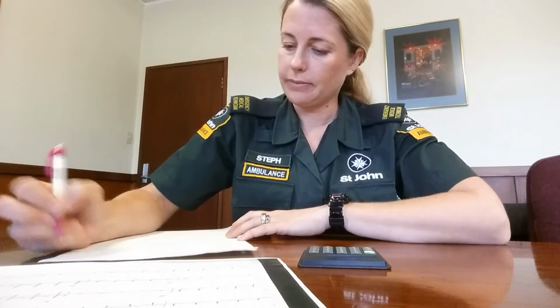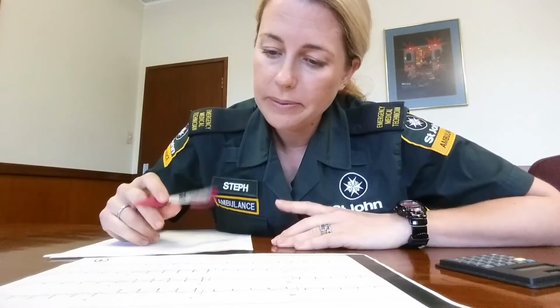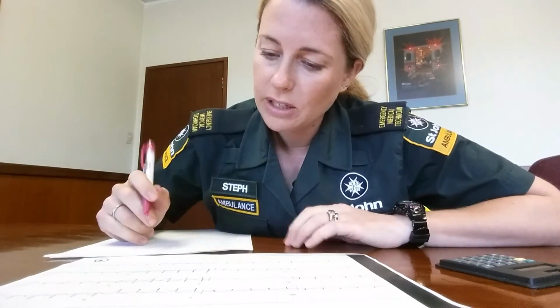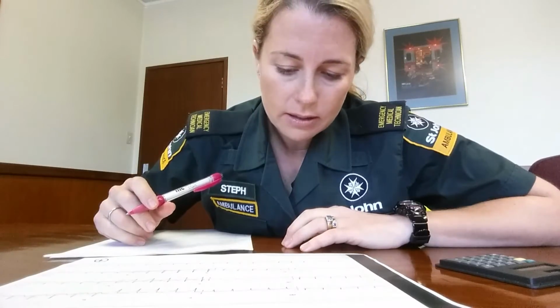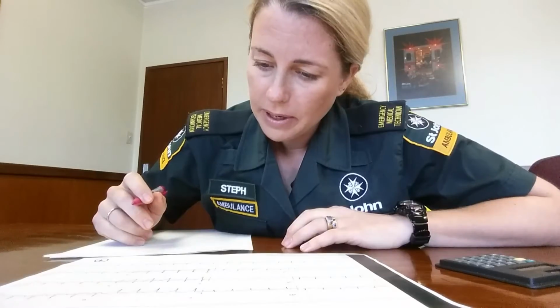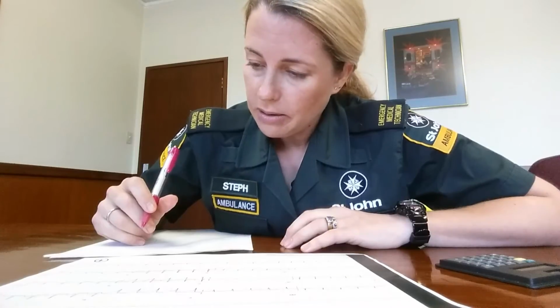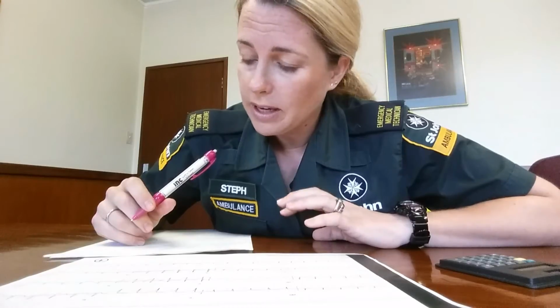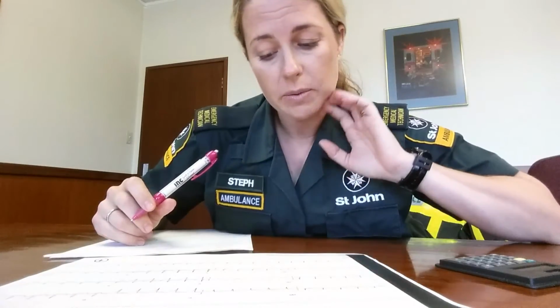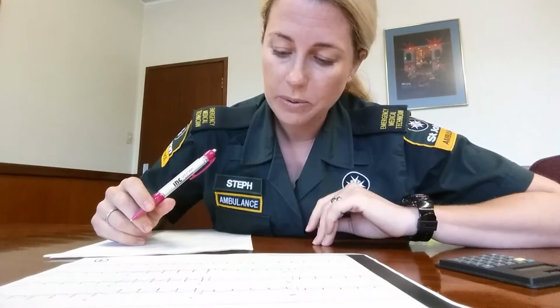Okay. Start your assessment. Okay, starting now. Okay, so having a look, I'm just going to do a general impression. Quite fast as well. My R wave progression is early, in V2, should be in V3. And my calibration spike is 0.20 seconds wide and 10 mil high, which is normal. I've got no frequency response, which should be 0.05 to 150 hertz. Don't have any of that. No paper speed, which should be 25 mil per second.